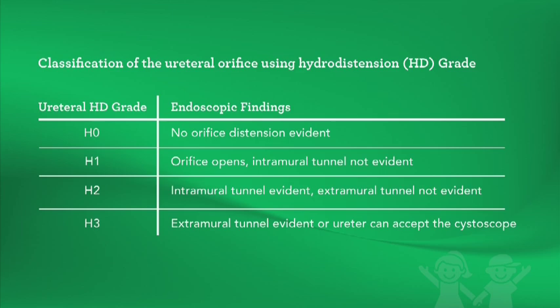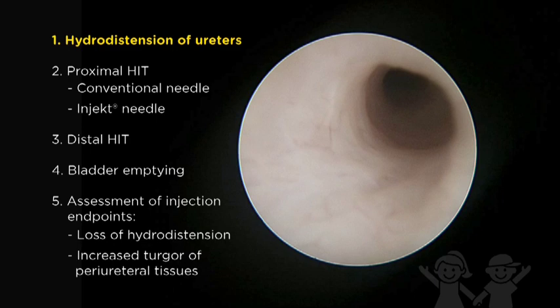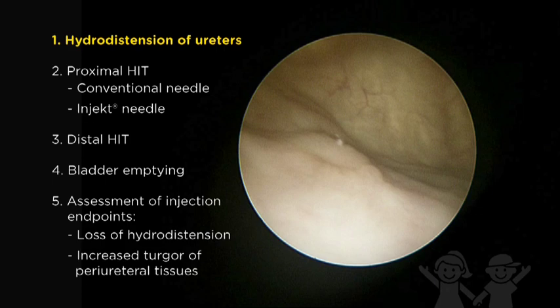Hydrodistension is graded according to the distensibility of the ureteral orifice, with a non-hydrodistending ureter graded as H0 and the most significant degree of hydrodistension graded as H3, where the extramural tunnel is evident outside of the bladder. Hydrodistension allows visualization of the intraluminal injection site as well as assessment of injection progress. Ureteral hydrodistension causes the orifice to open before treatment, but following proper implantation, the ureter should remain closed with an H0 grade.